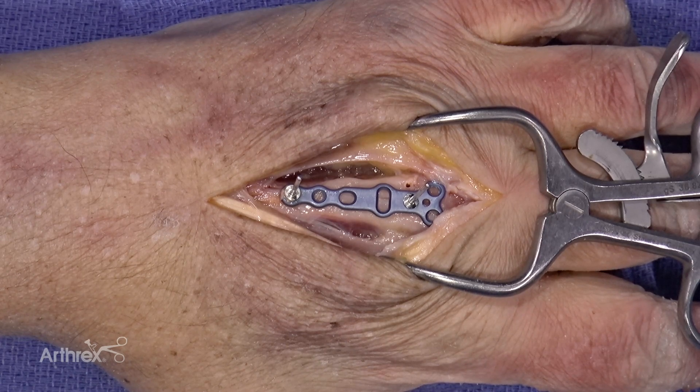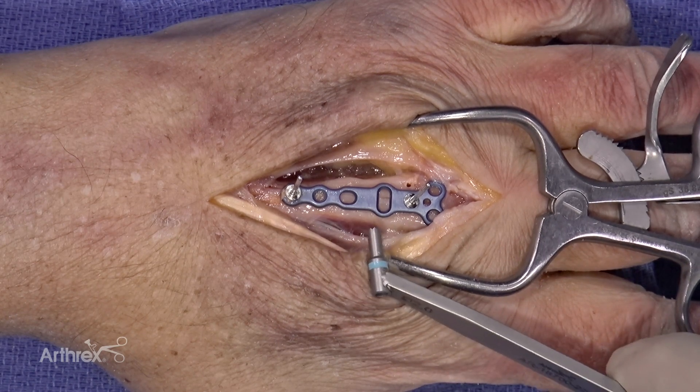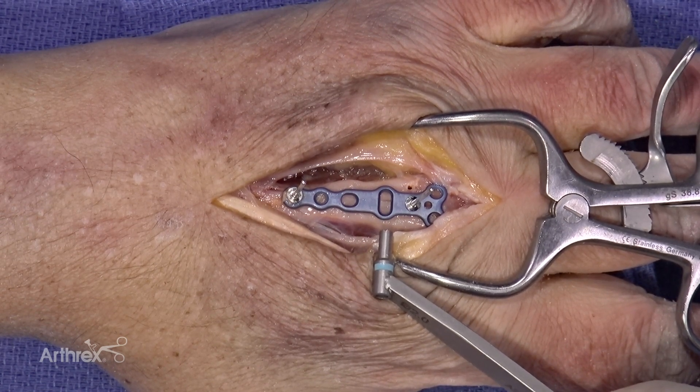In doing so, I have placed the Y portion of the plate distal over the distal metaphysis. You will see in the center of the plate there is an oblong hole that is oriented in a perpendicular fashion, and this is what we will use to gain a rotational correction. Once I've pinned the plate in place, I have confirmed via fluoroscopy that the plate is in the appropriate position.